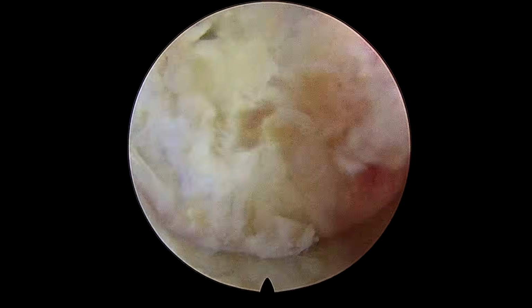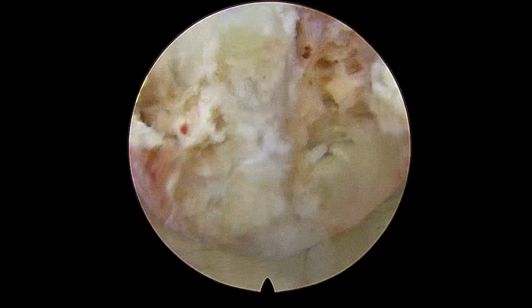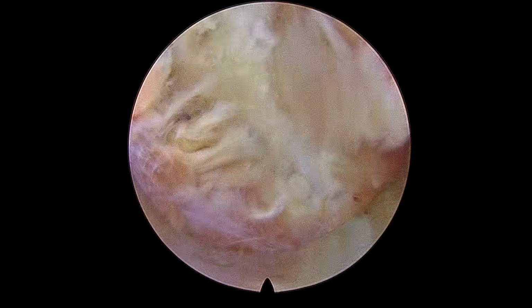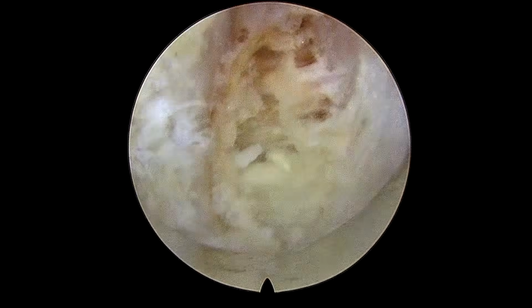Now we have exposed the superior lamina and the inferior lamina. So I'll do a dissection more laterally and identify the lateral mass and the V, which is one of the most important landmarks for cervical endoscopy.